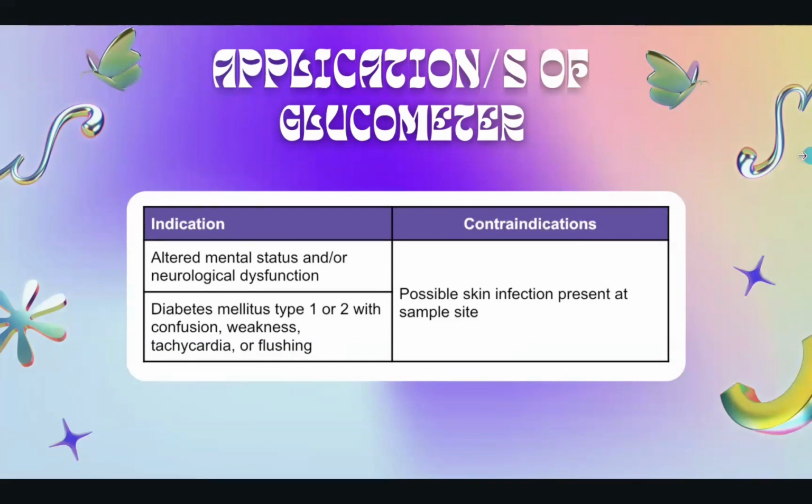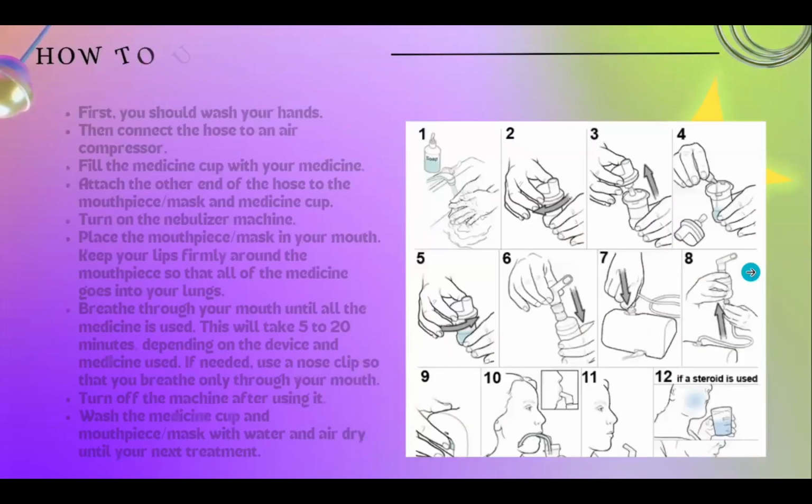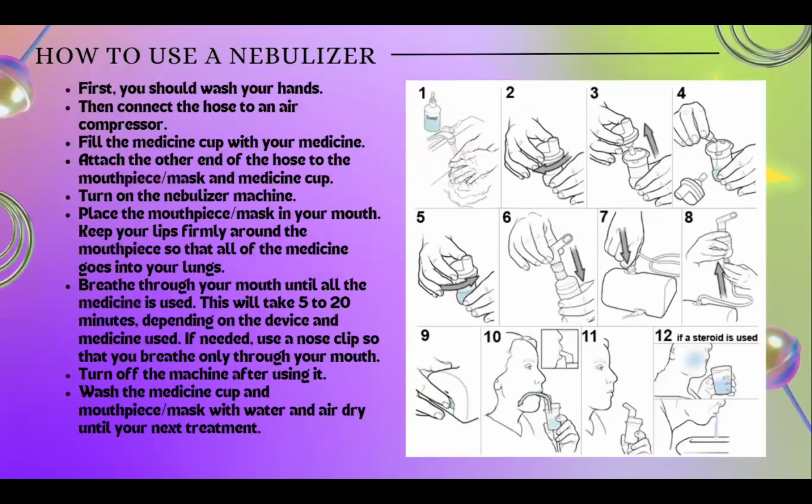Next, we have my groupmate who will discuss how to use these devices. How to use a nebulizer.